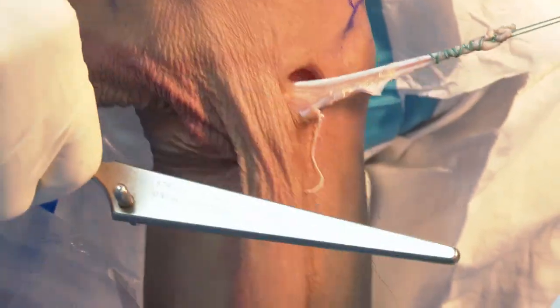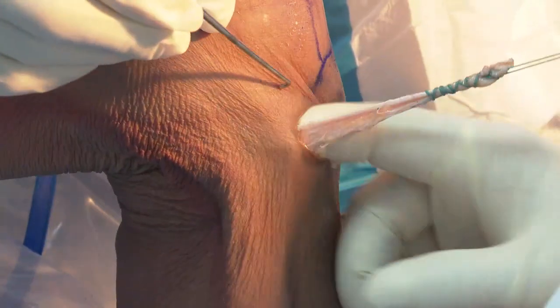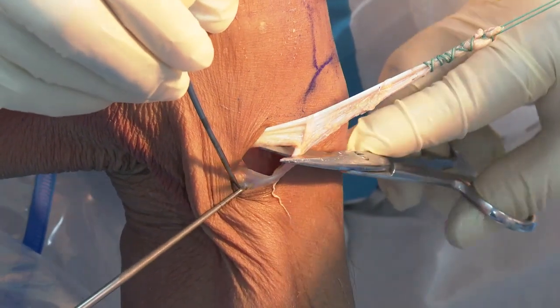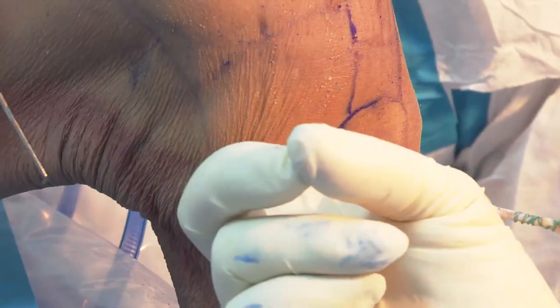Okay, so we cut the first branch. Okay, and then you bend the knee more. Bend the knee, put your finger in, okay? Put your finger like that. Continue, and hook the branch, okay? Very easy. Use your finger, okay? Just use your hand. Like that, okay? Now, I feel no more branch, okay? Yeah, we can feel this.